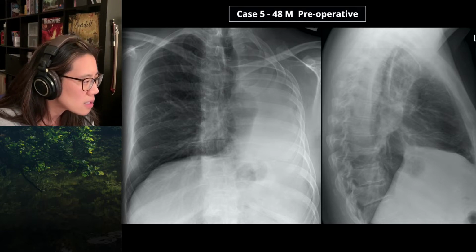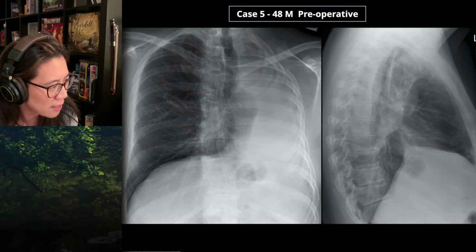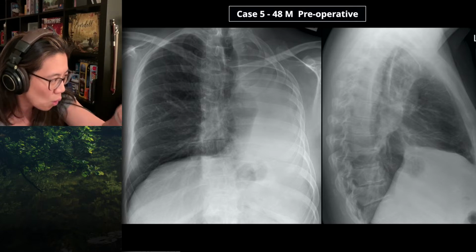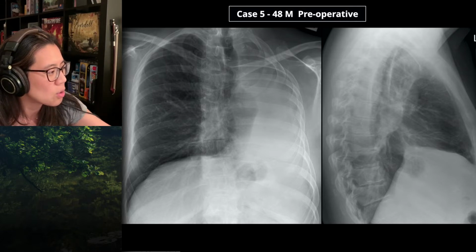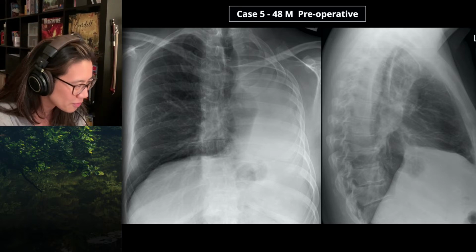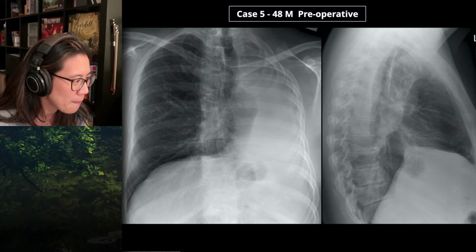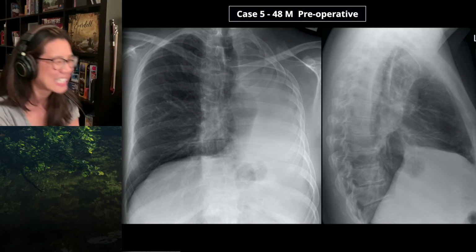The area of lung that is projected over where you'd expect the liver, spleen and stomach to be, because the lung goes all the way down to... You can actually see how far it goes down in this guy. If you look carefully, you can see these pulmonary vessels way down below the liver. And that's a really good place to hide. And I've missed a 5 centimetre cancer down there.